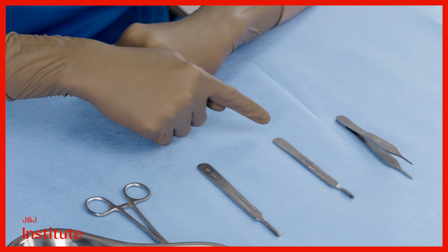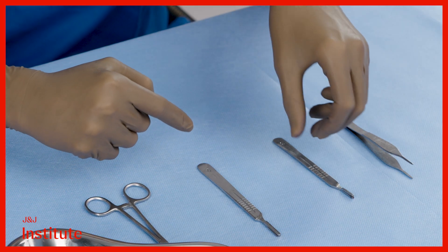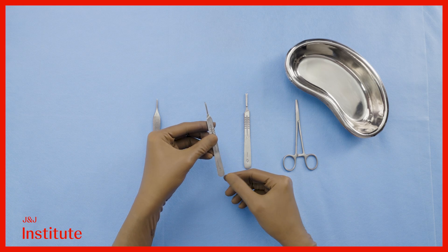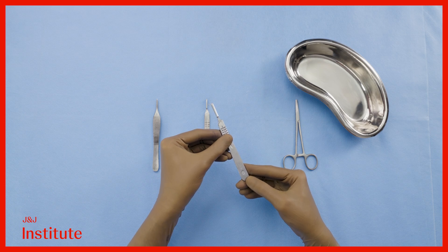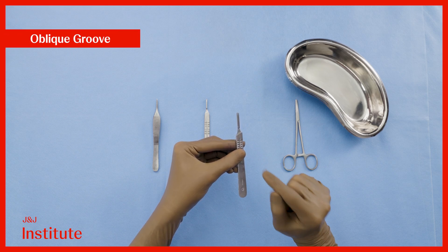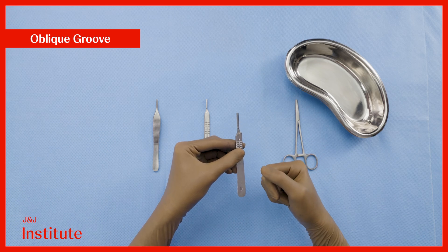A scalpel comprises of a Bard-Parker handle and a disposable blade. Here, I have two of the most commonly used sizes of BP handle. On my left is a number 3 handle, which you can see has the number 3 clearly embossed there. And on the right side, there is a number 4 handle, once again with a clear marking. Notice that at the working end of the handle, there is always an oblique groove that is designed to align with the base of the blade that we attach to the handle.